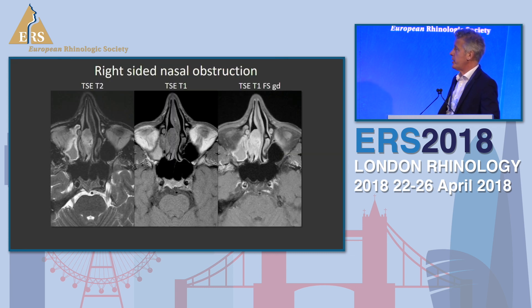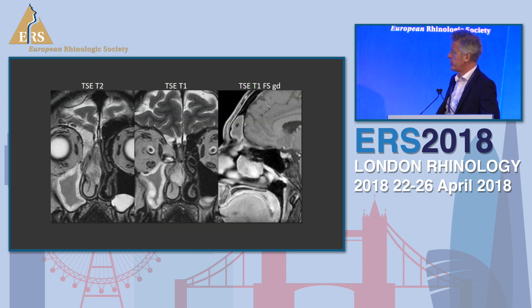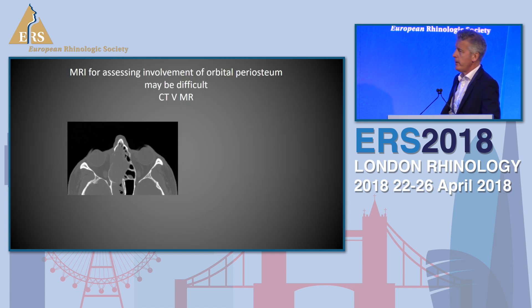Here's the routine MRI sequences. You've got the T2, the T1, and you can see the vessels and avid enhancement. That's the routine workhorse in this patient with an olfactory neuroblastoma. You can see it again on the coronal - here is the tumour - and on the sagittal.